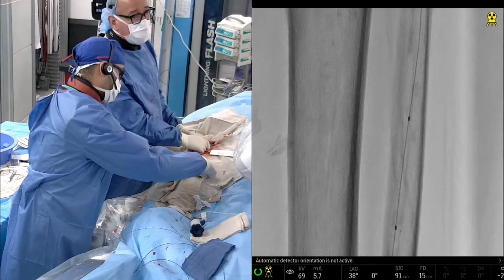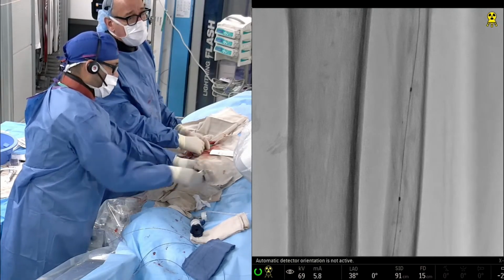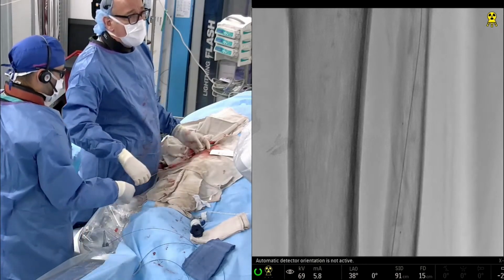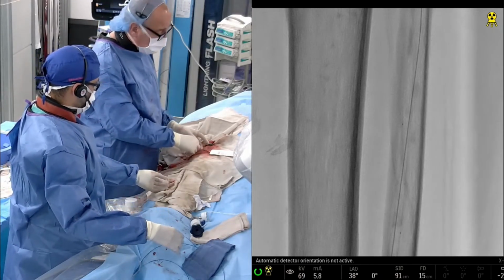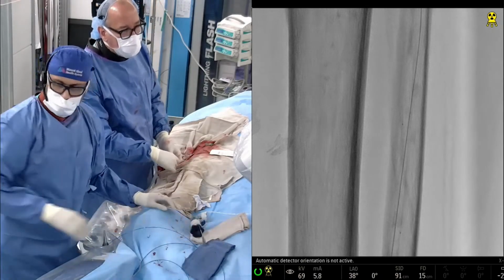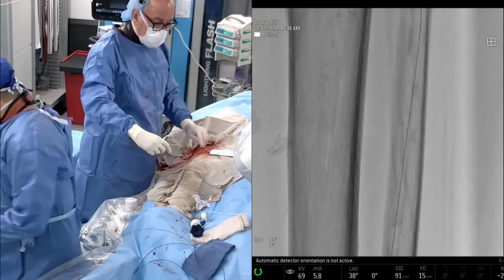And it's a great question, but my protocol is, again, I'm watching the radiopaque markers; they're not moving. And so I'm going to take this out, and then we're going to get the second scaffold. And again, you see the platinum markers there. It's a little bit hard to see. I'm on high mag to make sure that everybody understands what they should expect to be looking for. And let's get the second scaffold ready. Second one. Oh, yep.